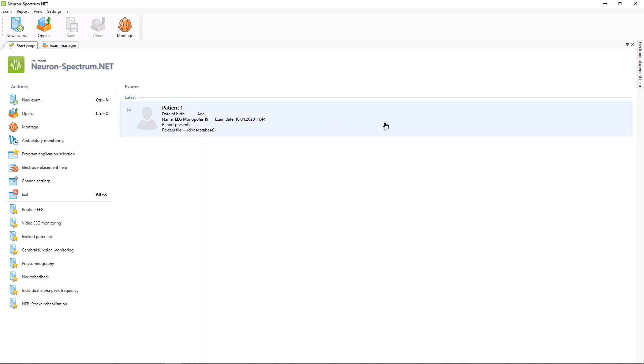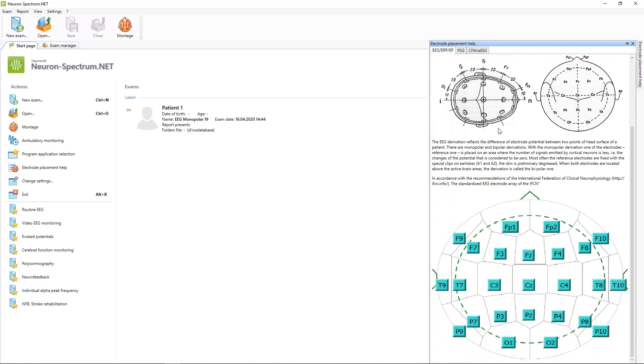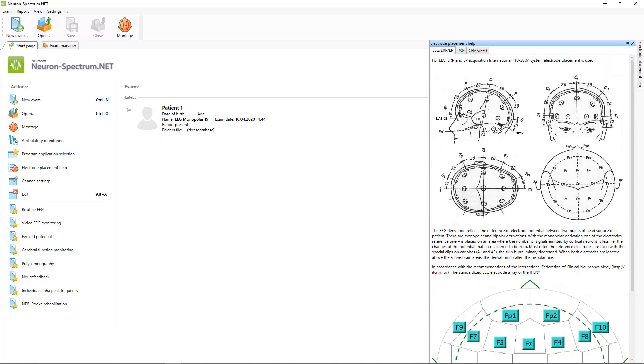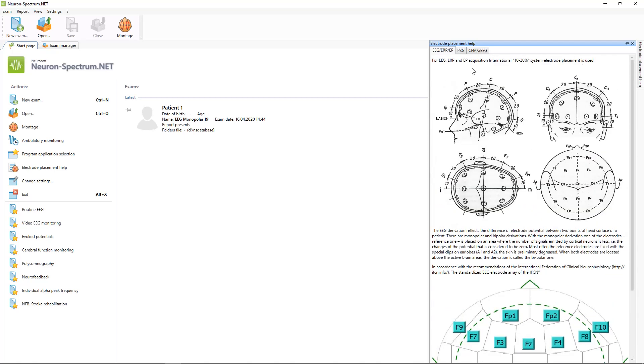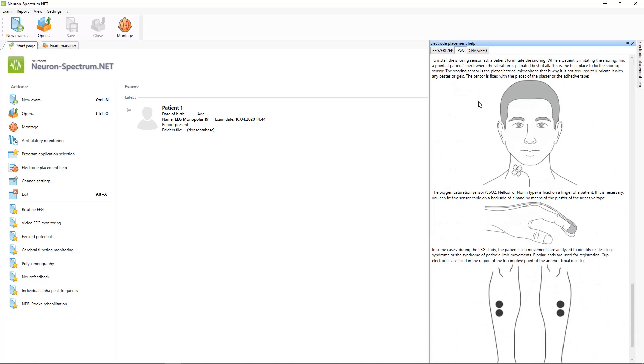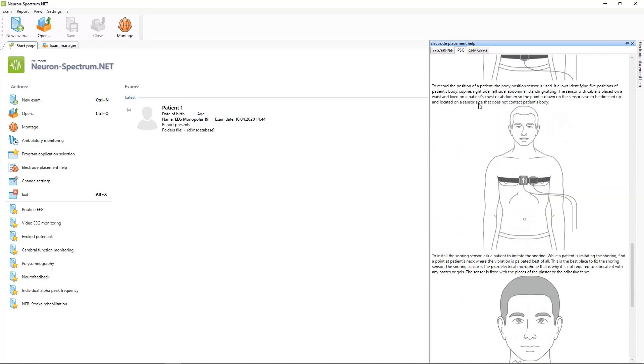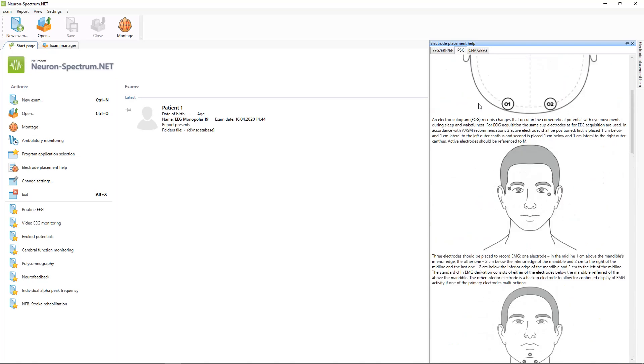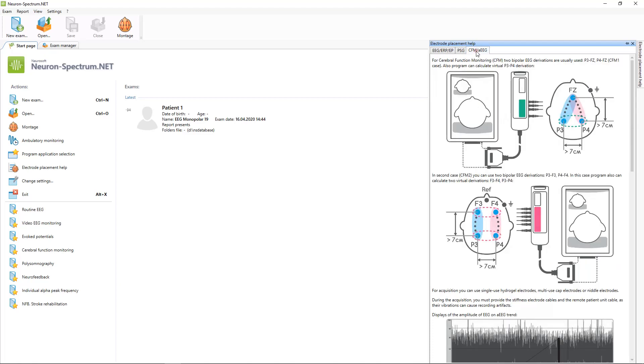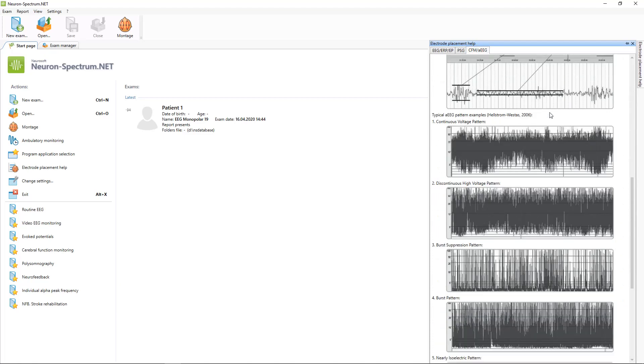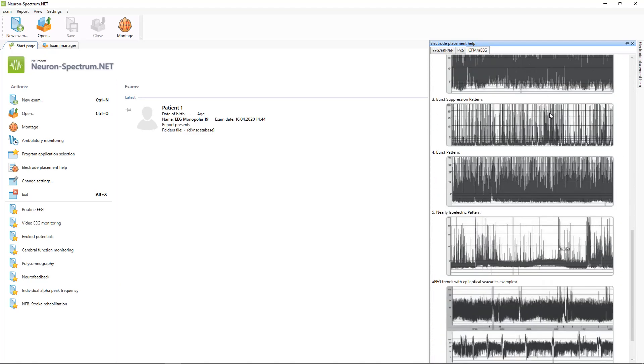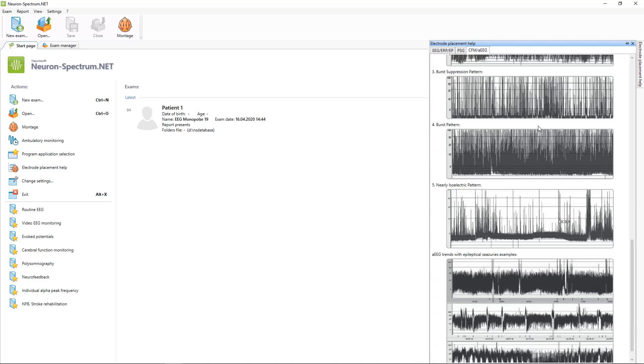Also on the start page you can see the electrode placement help window, where you can review information about electrode placement for routine EEG examination, for polysomnography examination, and for cerebral function monitoring. Also here you can see templates for amplitude integrated EEG trends.